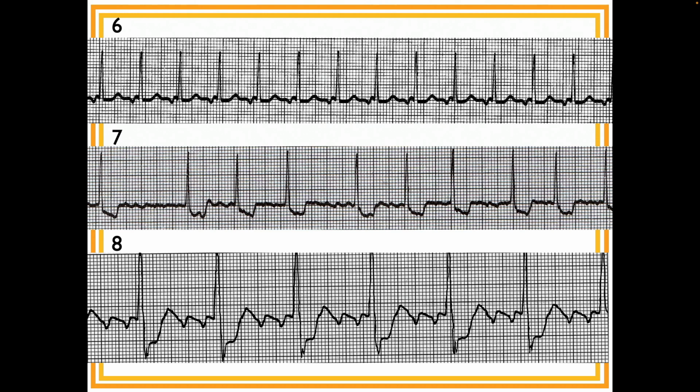One second. What was number 5? Junctional tach. So it's regular, it's got inverted P's, and the rate's above 100. Oh, is that number 5? I don't know, what was number 5? Oh, accelerated. Yeah, accelerated junctional, sorry.